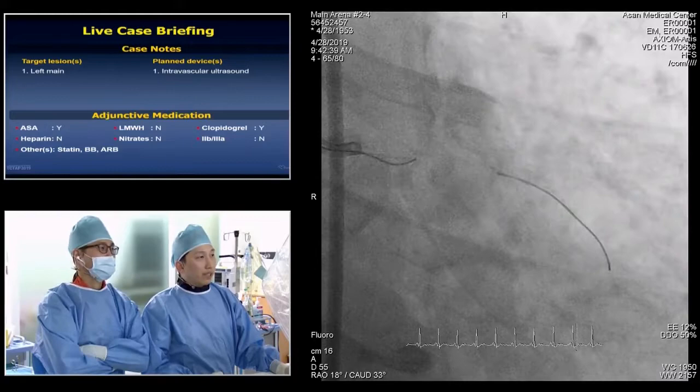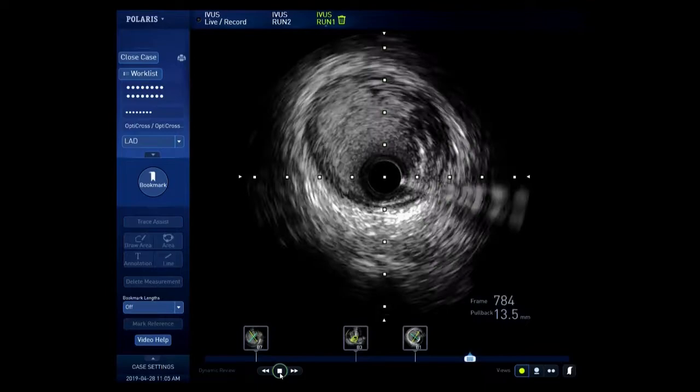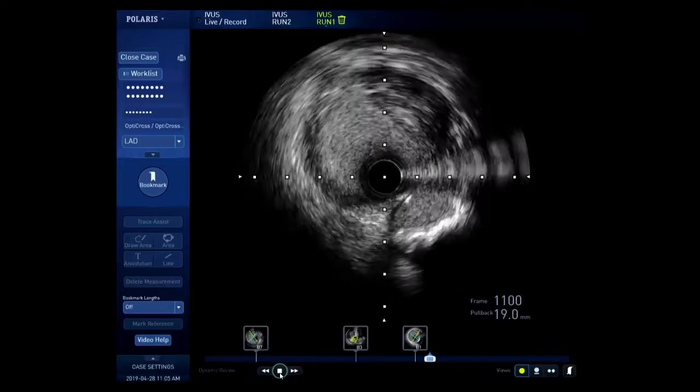I'd like to make a prediction before you show the IVUS, and that's that there's not going to be such a disparity. I think the proximal LAD is going to be at least 3.5 millimeters or more. So probably 4, maybe 4.5, and there's going to be diffuse proximal disease. So to me, this is a chip shot PCI. That's what I'm expecting the IVUS will show us.